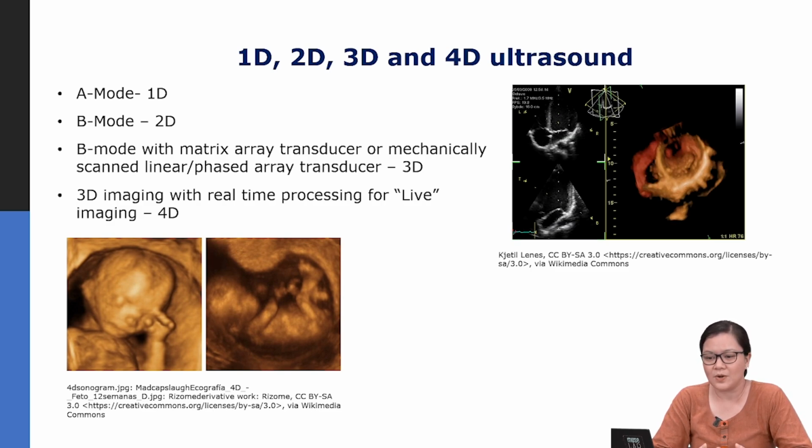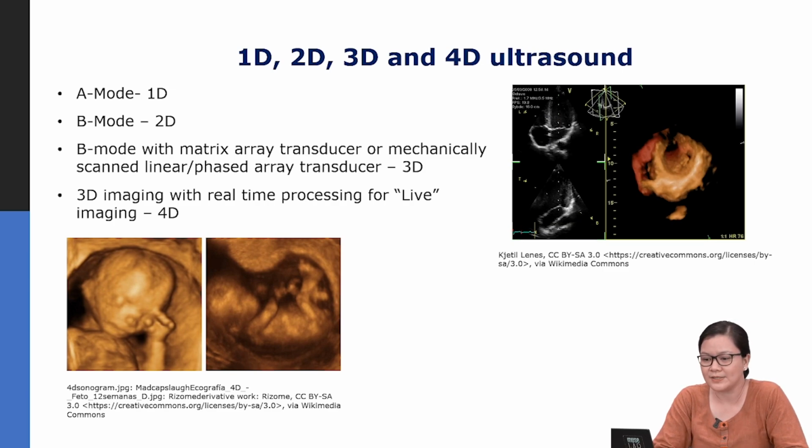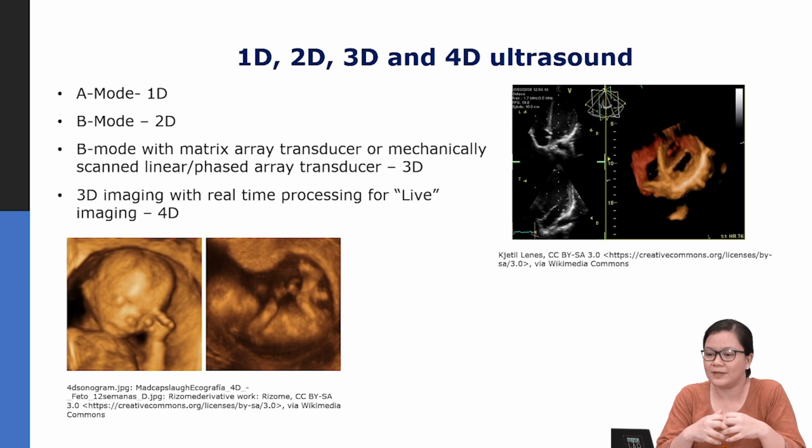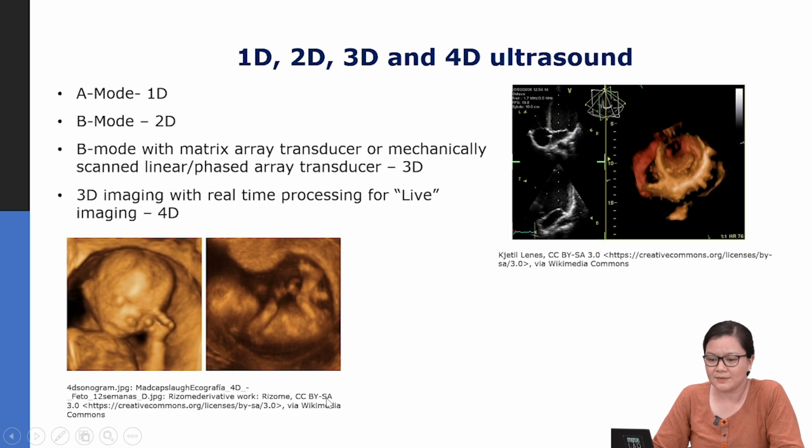And if we collect a 3D ultrasound image over time and we process it, and that has capability for live imaging, as in 4D ultrasound.